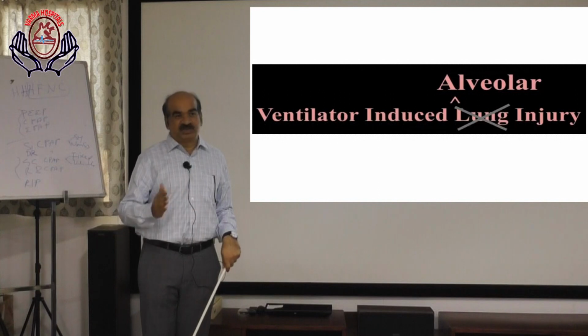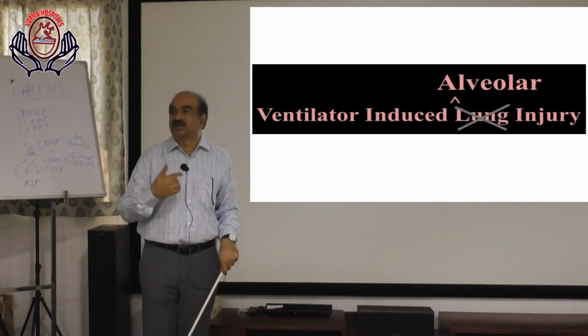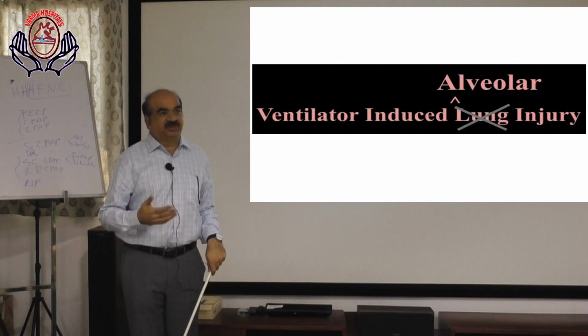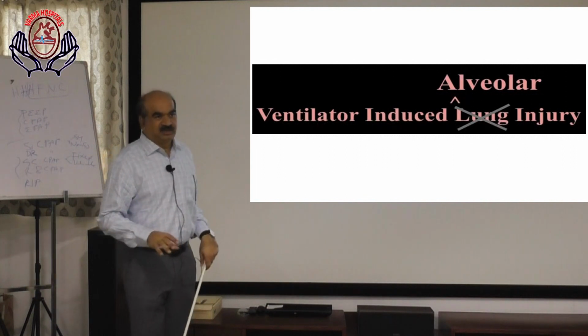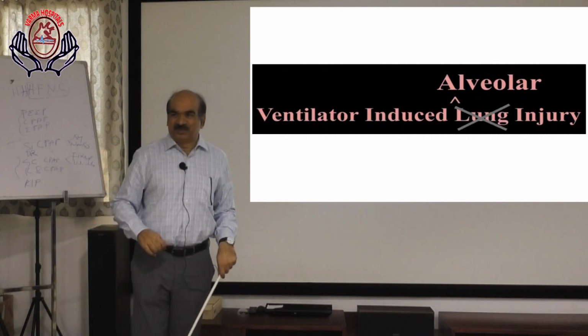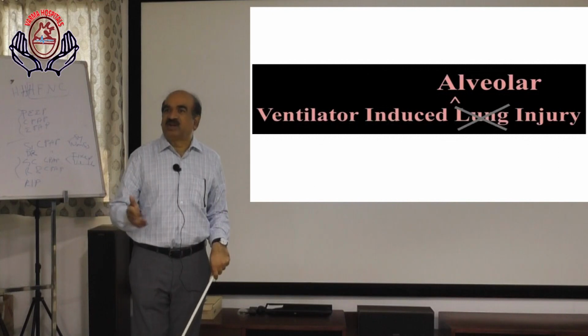It's called physician-induced lung injury. Mostly, in 99% of situations, it is the disease itself. The disease itself will cause lung injury. Inexperienced hands, that is operator-induced, physician-induced lung injury. Okay? Ventilator is a lovely machine. How can it cause lung injury? Only the disease will cause further lung injury, or the operator.